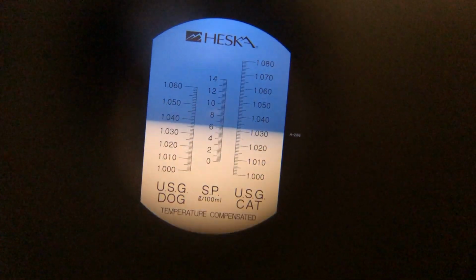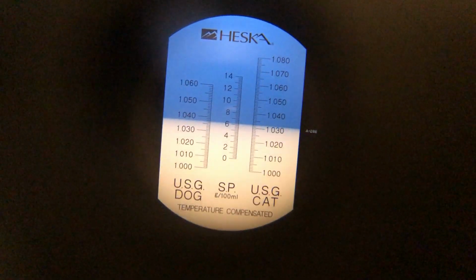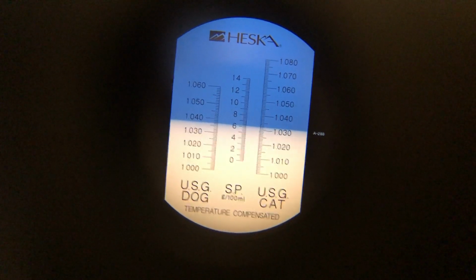So you can see there's a dark area above and a light area below, and where those two meet and intersect, that's where we're going to read our urine-specific gravity. This refractometer has urine-specific gravity for the dog on the left and for the cat on the right. Riker is a dog.